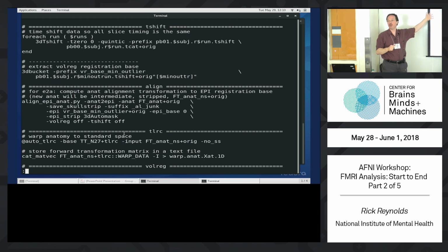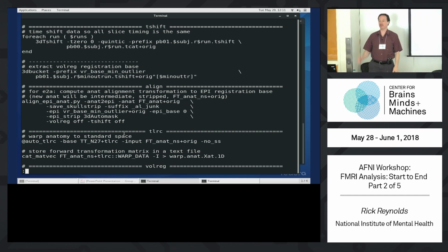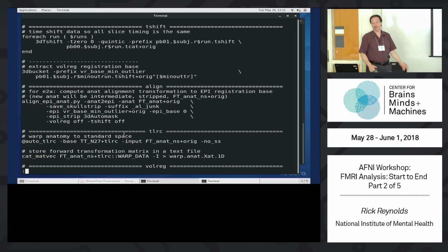If your TR is short, 1 second, 0.8 seconds, maybe you think, do I really care? Because you've got to interpolate the noise along with the data, so nothing is easy, right? So always choices. So you can ponder these things. In our case, maybe it is reasonable. Of course, we have a 20-second stimulus design with a 35-second response function. Is this going to make any difference? No, we don't really care. But that's an example with a 2-second TR.